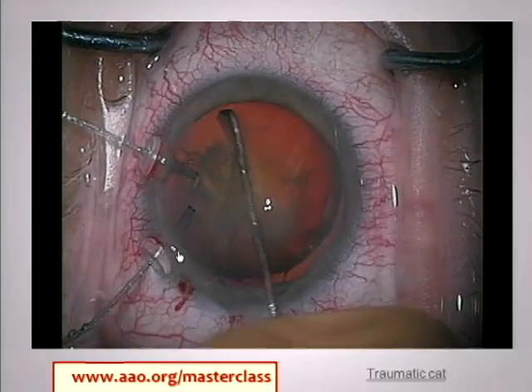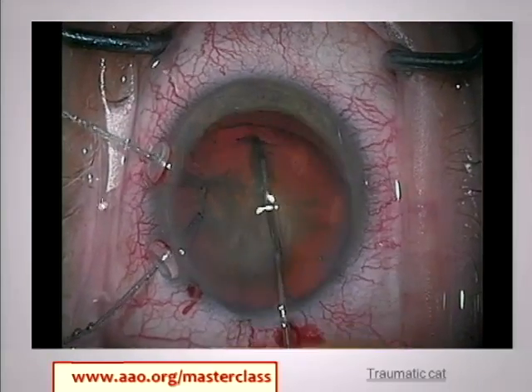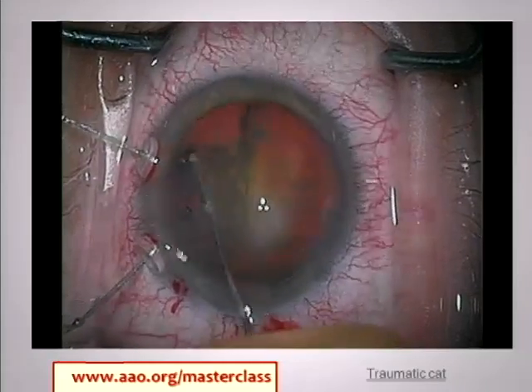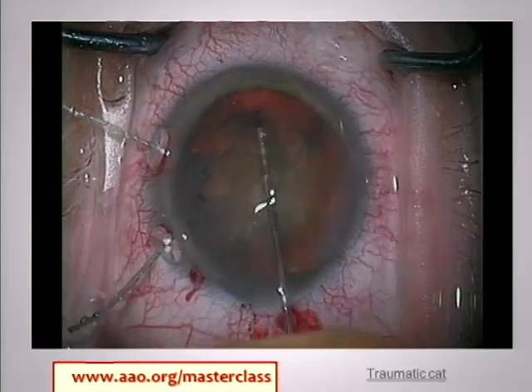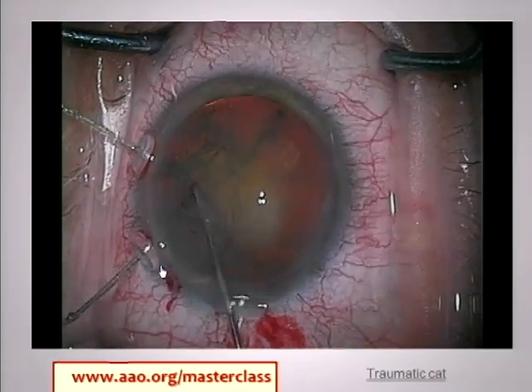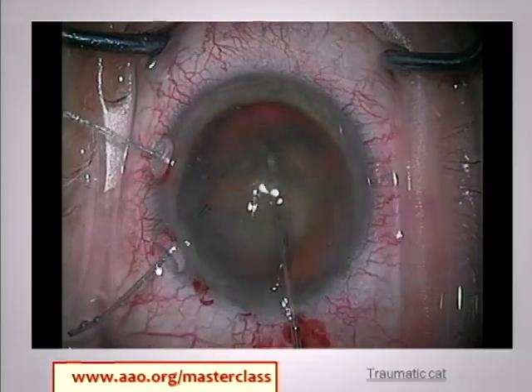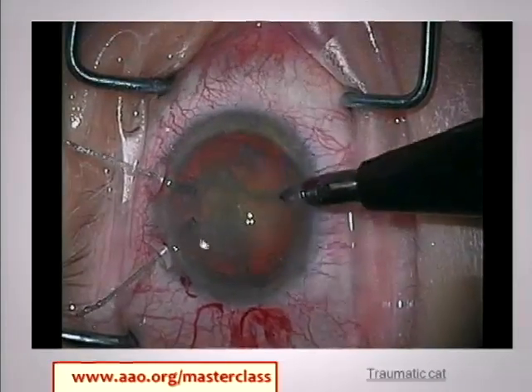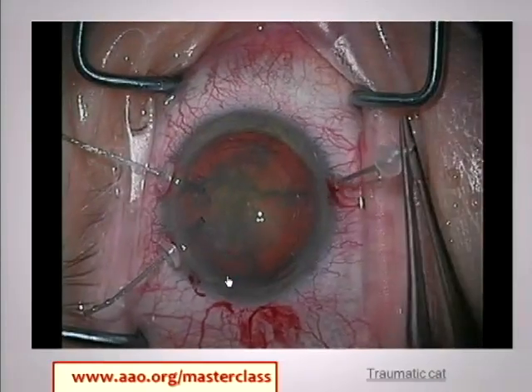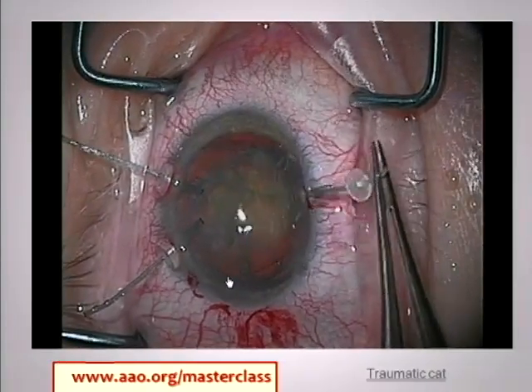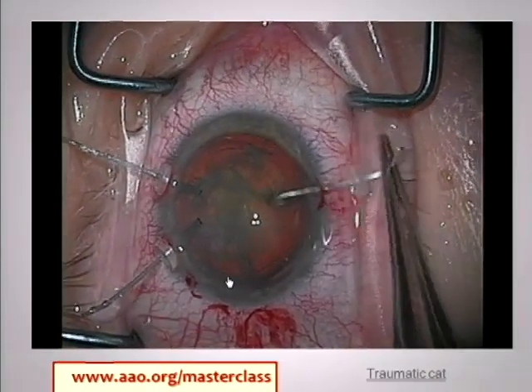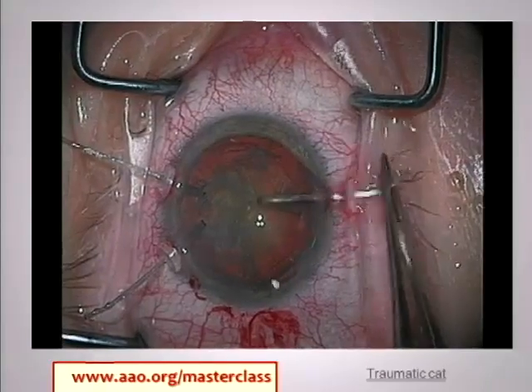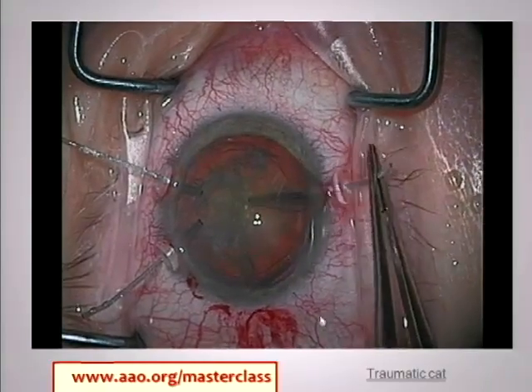One pearl I have: I will put these in before rotating the nucleus because they're going to pin the bag to the eye and give you more rotational stability of the bag. Here I go in with the hydrodissection. This is the area where there's a little bit of tilt, and you can see that this holds things for me. I'll put in my third one because I just want to stabilize the bag further.